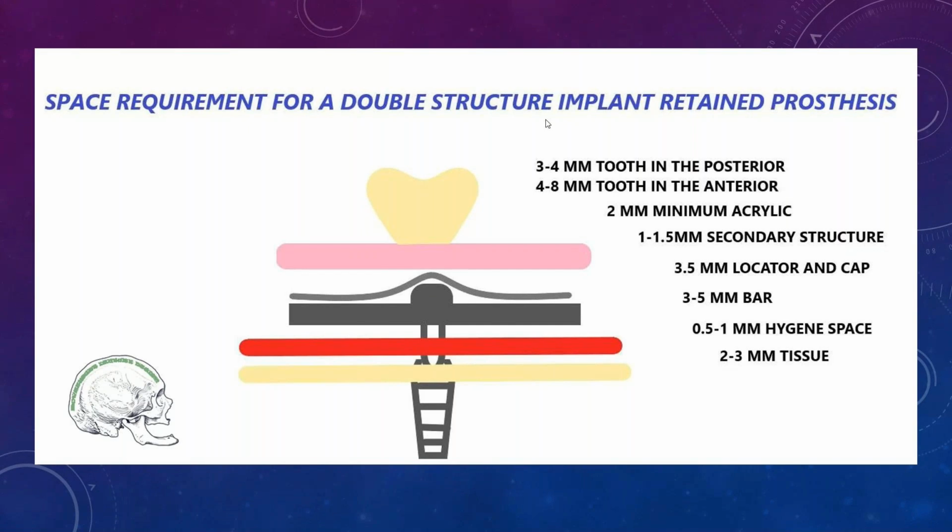That's not true. I've seen things pretty tight to the tissue, and food and bacteria still get impacted underneath it, and you'll see tissue inflammation and bone loss down the line. Inevitably you're going to have a cleansability problem under the bar, but you also end up losing some bone around the implants, which could be very dangerous. The bar height remains the same.